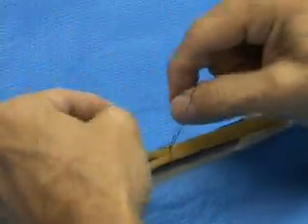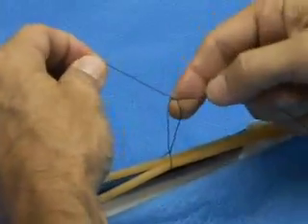We're going to do a demonstration this morning of some very simple suture techniques, first showing a two-handed square knot. It's a very basic knot that's used in the operating room. It's important to use a square knot because square knots don't slip.